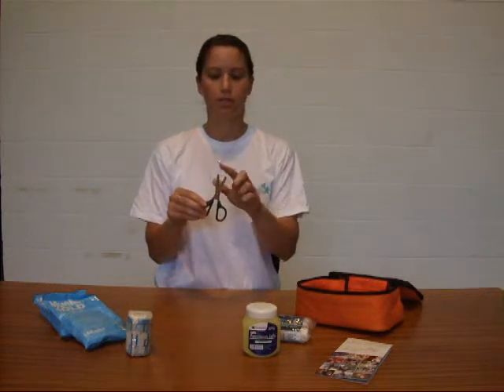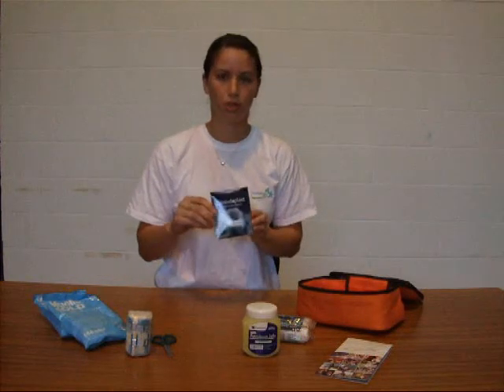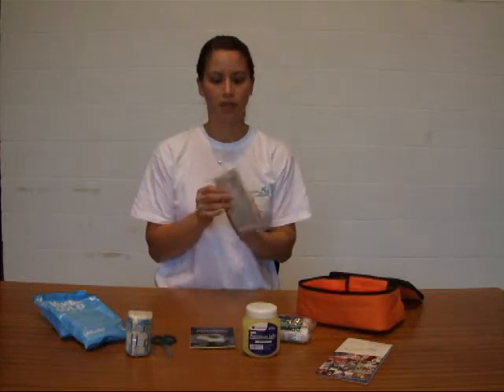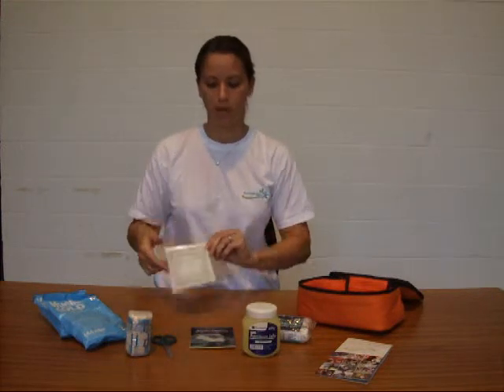We've got some blunt-ended scissors — two rounded ends so you're not likely to puncture anybody's skin. We've got a packet of normal-sized plasters, and we've also got a packet of large plasters — fantastic size, much larger than normal plasters, so you can just stick that on any wound and get them straight back onto the pitch again.